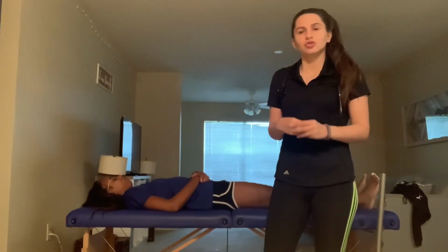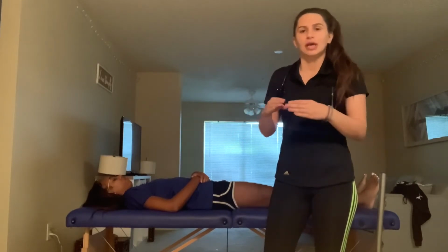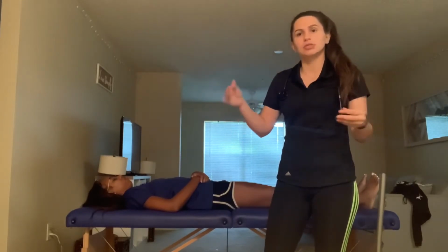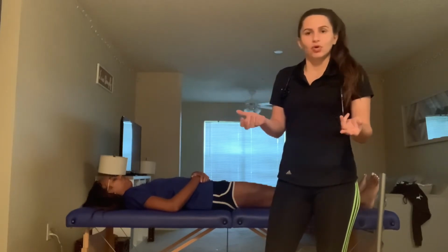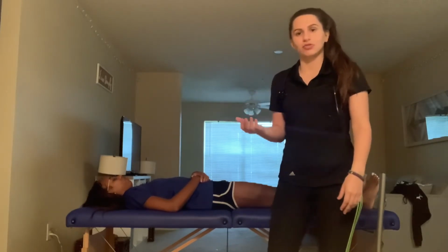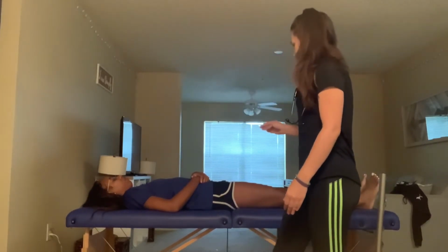These will be sound tests, not pain tests, and the sharp or dull sound heard through the stethoscope will differentiate to the PT whether there is a suspected stress fracture or not. Normal unfractured bone will have a very clean, distinct sound. Bone with a defect, like a fracture, will present with a more muffled, diffused, washed-out sound.